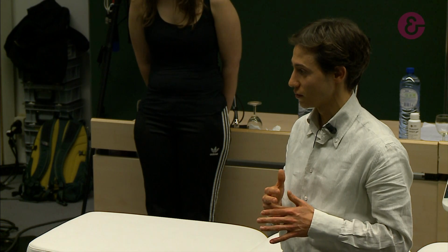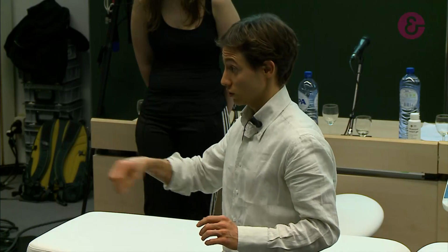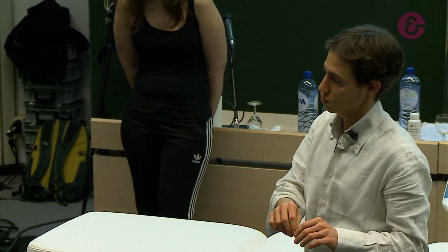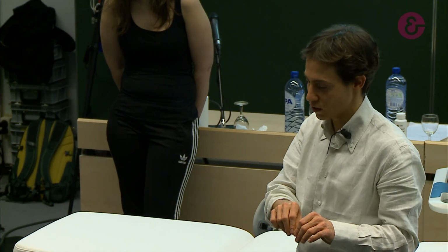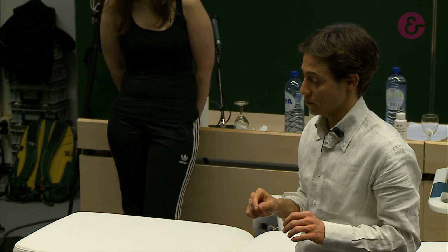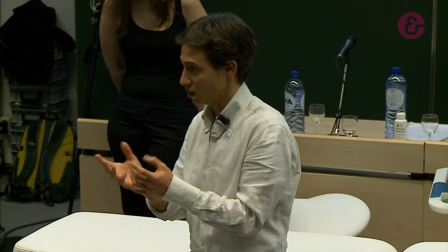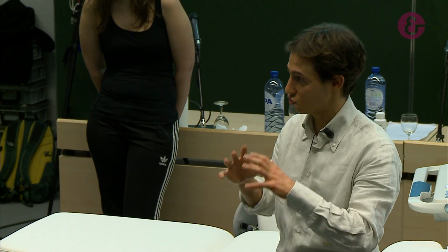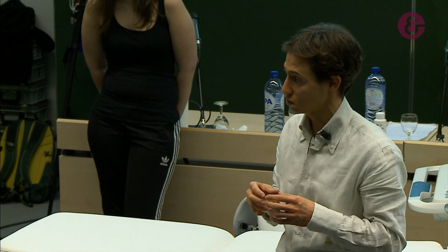Directly after the first session already, or do you say, no, I want to check if she or he can stabilize in one position, and then I say, okay, you can try it at home? So I work once per week with the patients, or once every 2 weeks. And I try to be very focused, in accordance with my clinical examination. If I can find that the poor control is in that direction, I try to start as soon as possible in that direction.